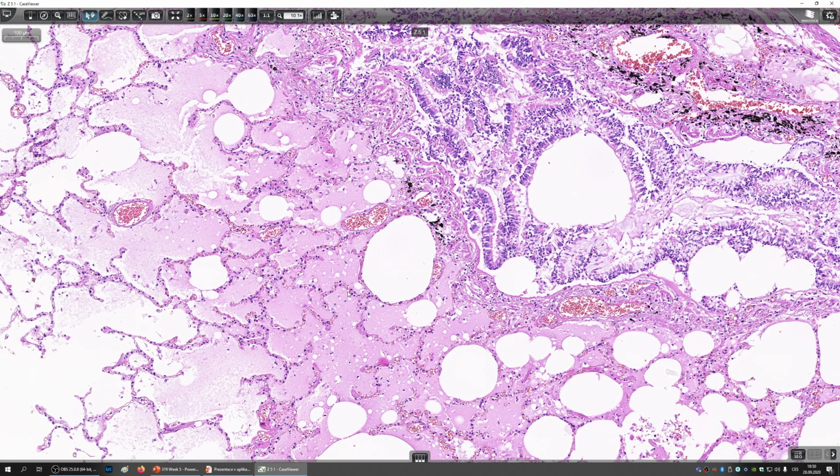extracellular space. So whenever there is some kind of process leading to edema, either venostasis or acute inflammation, you can get exudate or transsudate. So please learn the difference between exudate and transsudate. You can read about this in the theoretical part of our lectures, so please give some time to it and learn the differences, because we will be talking about exudate and transsudate a lot.